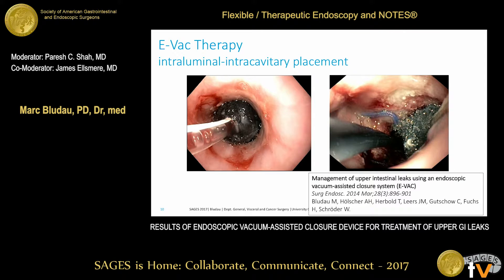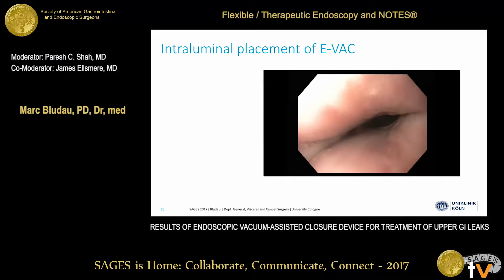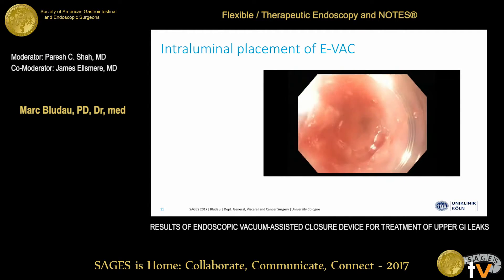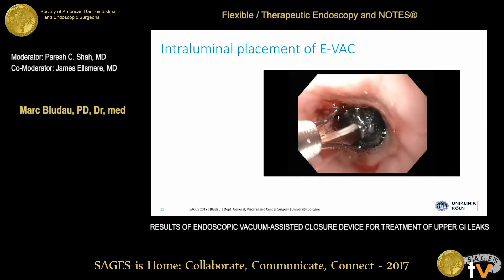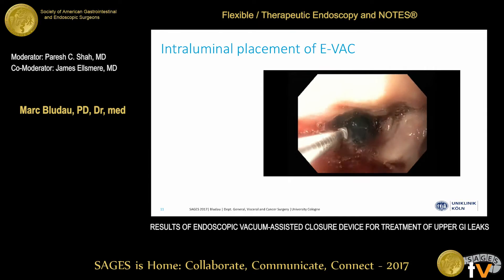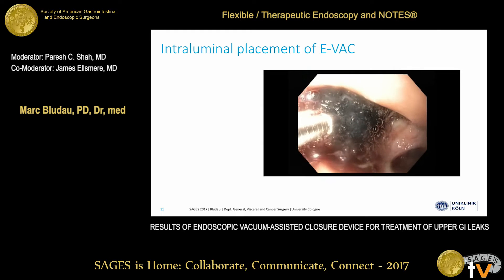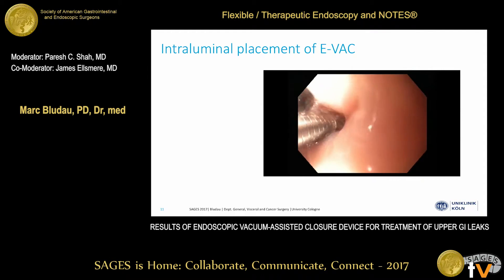In 2014 we published our first series of 14 patients. We have two possibilities to place the vacuum therapy: intraluminally and intracavitary. Here is the first video showing placement of EVAC in the lumen of the esophagus. You can see the overtube; the sponge is placed intraluminally at the leak, and then the vacuum is applied.